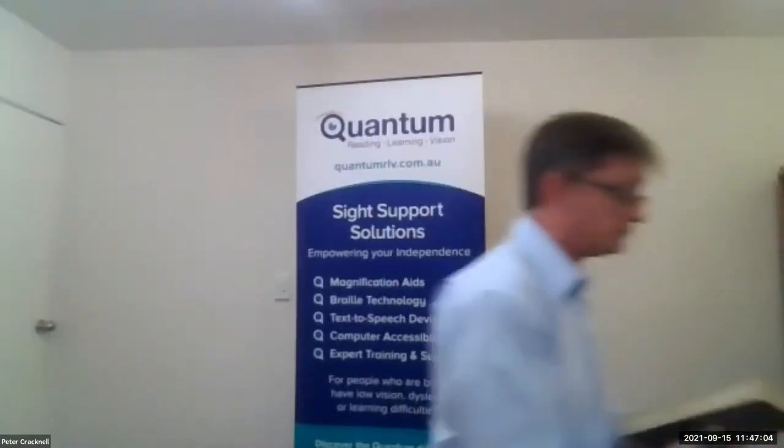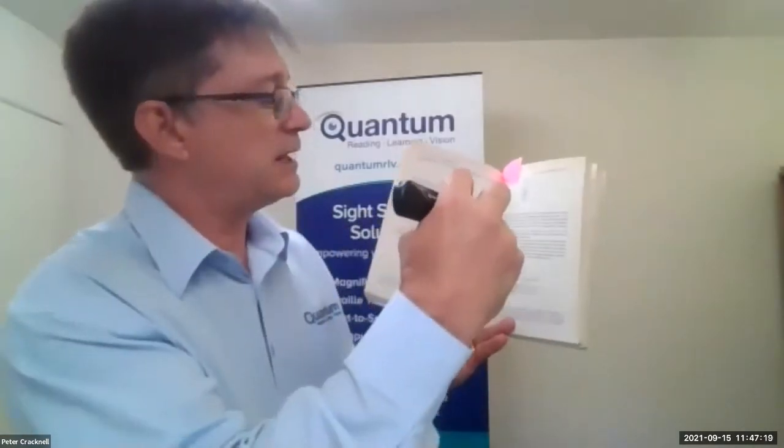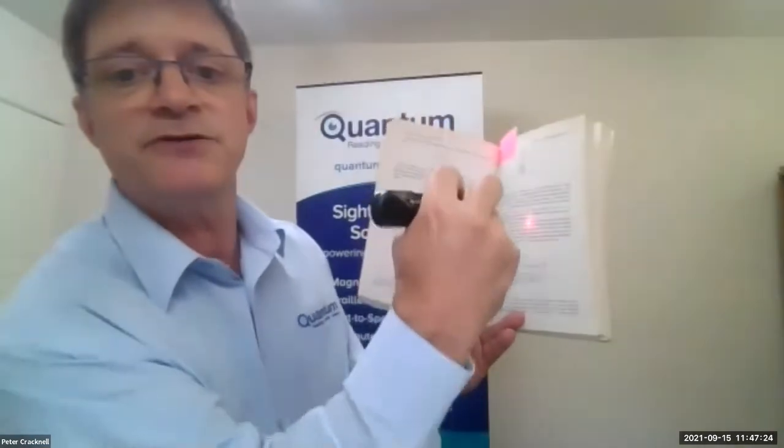So I'm just going to give a demonstration. What we do is we have a trigger button at the front of the OrCam Read. We press the trigger button while aiming, and you may see there's a spot appearing on the book — it looks like a mouse pointer.